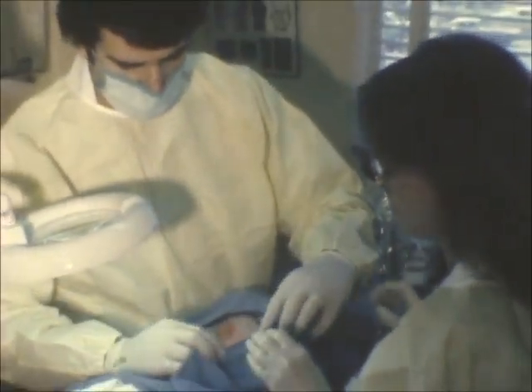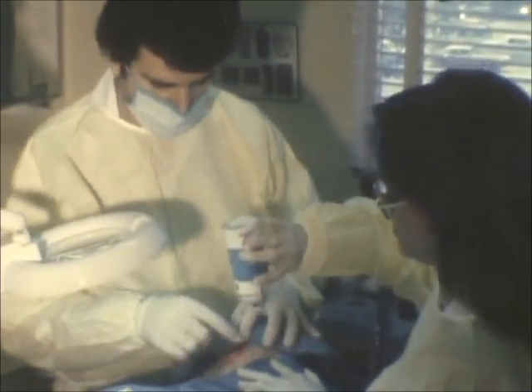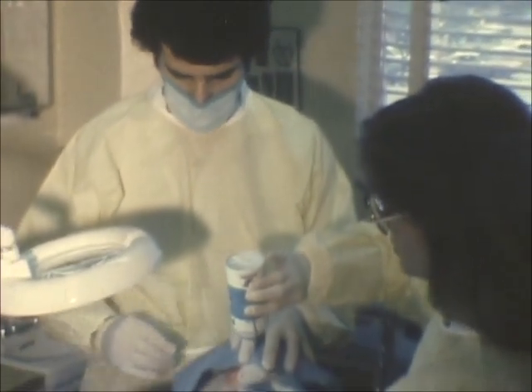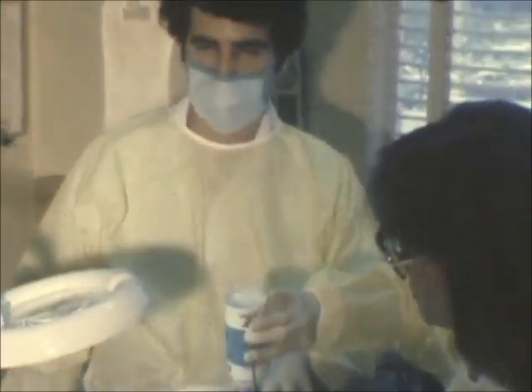We always shield the patient's eye and nose in case the brush slips.